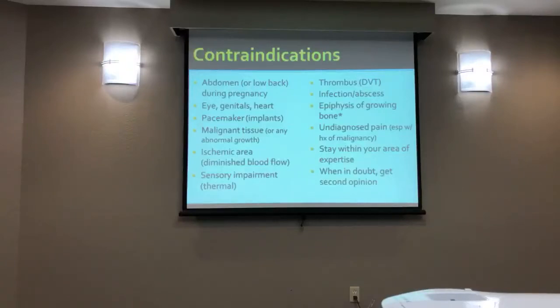I think these are the things that are interesting to talk about. Are people using non-thermal ultrasound in clinics? Are you using non-thermal? You are. I do that mostly. I have to say, when I do use it, I usually use more thermal levels. Am I using it aggressively thermally? Not really, but I'm using it more for the thermal benefit of heat and stretch to try to increase range of motion. I have been using the 50% more than 20%. My thought is, it's not well proven, you know what I mean, as you're pointing out.